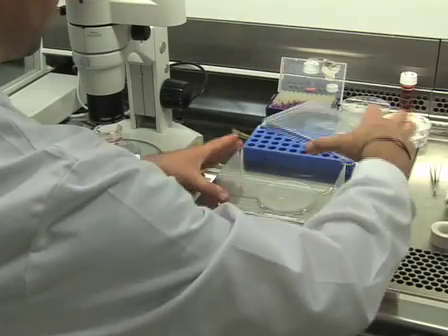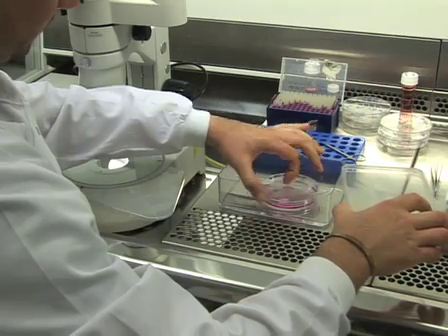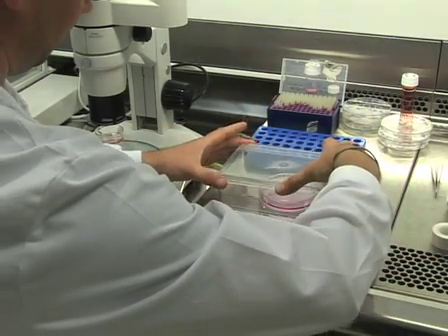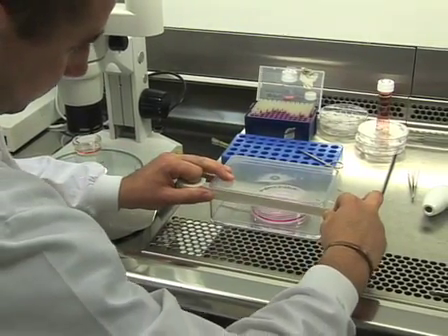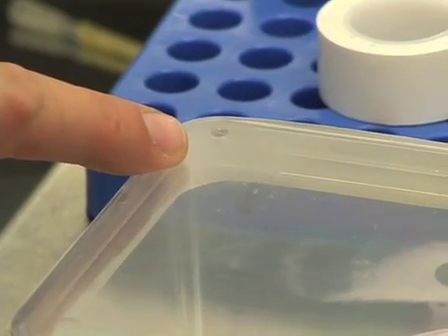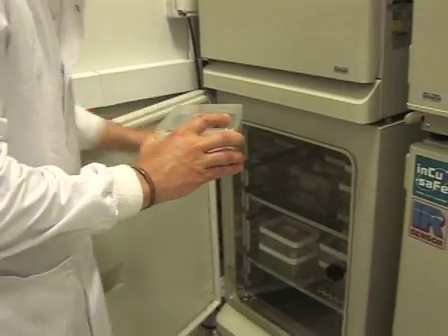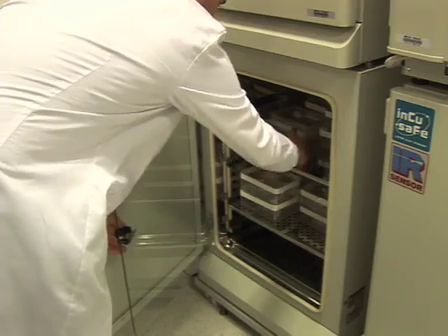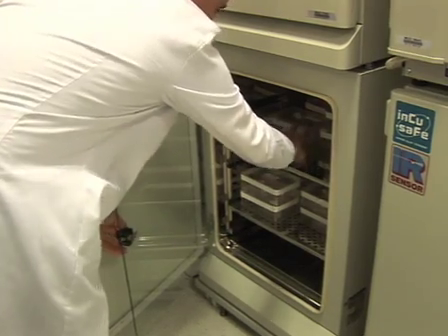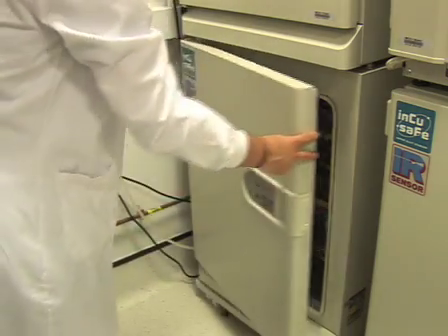Once the cultures are set up, assemble a sandwich box with a lid of a 10cm petri dish as a platform and double distilled water just below the level of the platform. Place up to 3 dishes into the box and seal the lid to the box with tape. The lid should have two 5mm air holes drilled into opposite corners. Place the boxes into a 37°C incubator with 10% CO2 for 5-7 days, after which time we disaggregate and then re-aggregate these cultures to study stromal-thymocyte interactions in a controlled three-dimensional environment.